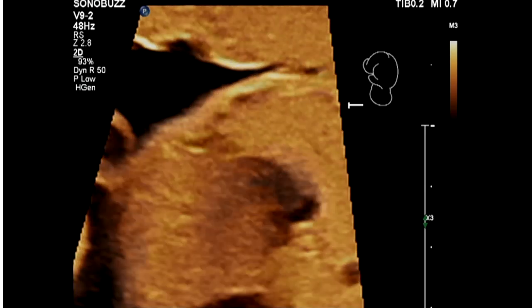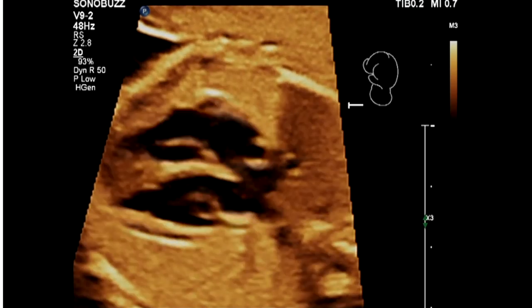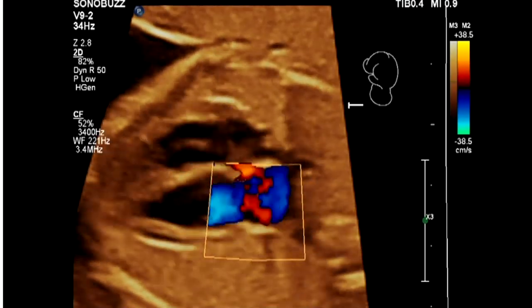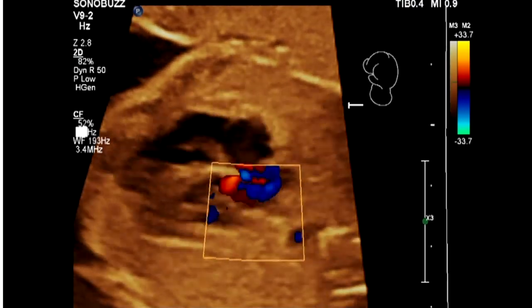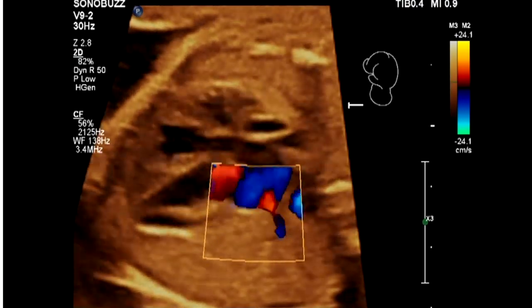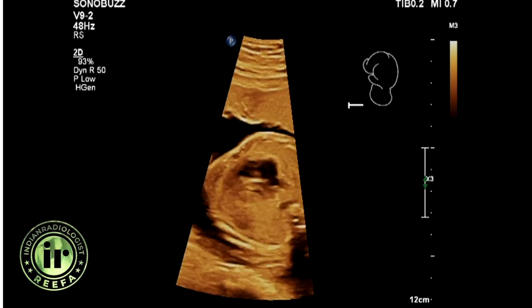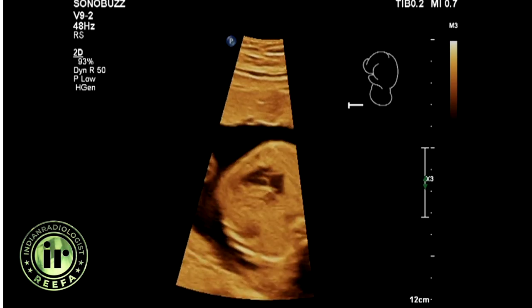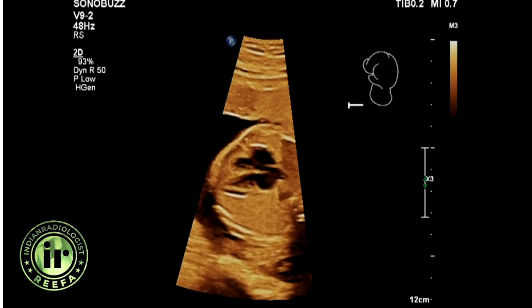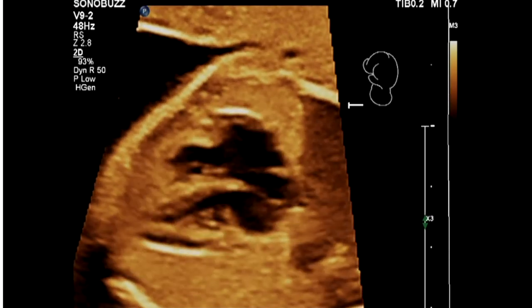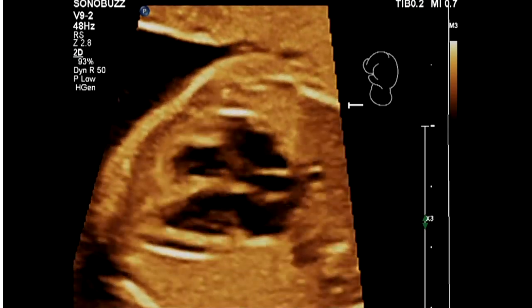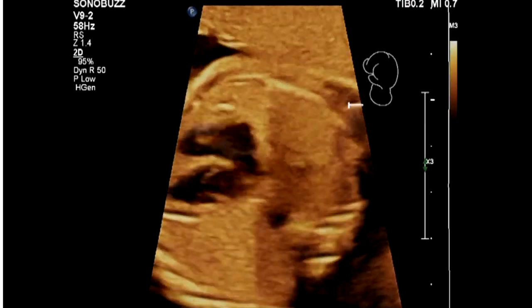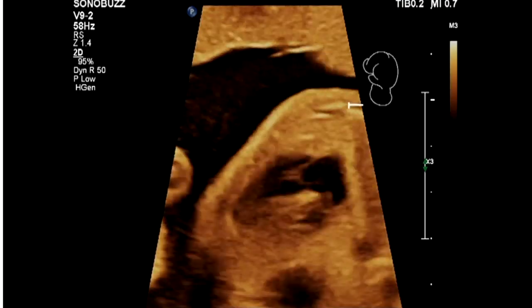I know this should be a vein coming up, and it should be red coming into the left atrium. Now let's see if we can get that — it should be coming right at the probe, red. There it is. You could lower the scale a little bit. That's a pulmonary vein coming in. Even one pulmonary vein is enough to rule out total anomalous pulmonary venous return. You can see the flap of the foramen ovale within the left atrium right here.